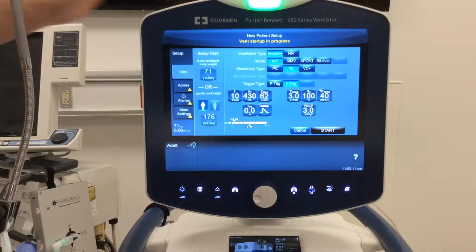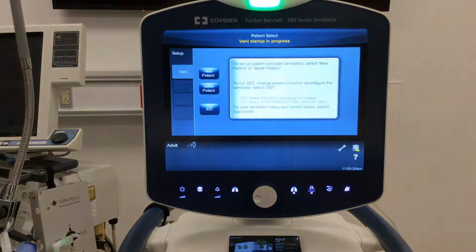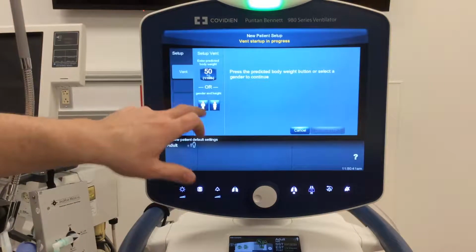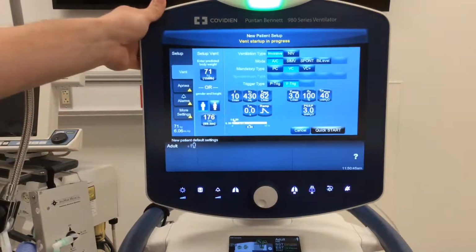Okay, so what we're going to do, and I'm going to have a handout that goes along with this particular lab, is I'm going to start you out with me giving you ventilator settings, okay, you having to figure out how to put them in, and then from there we're going to do a couple of little exercises that help us from a foundational aspect, okay, and understand some core concepts of when we're changing something, what effect that's really having on the overall condition of that patient. You can see if I don't do anything quickly, it jumps back to that other screen here, so I'm going to stop talking so much.